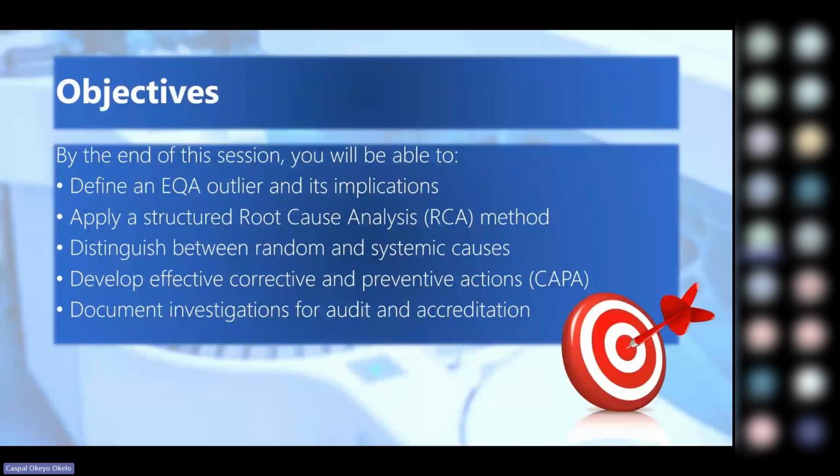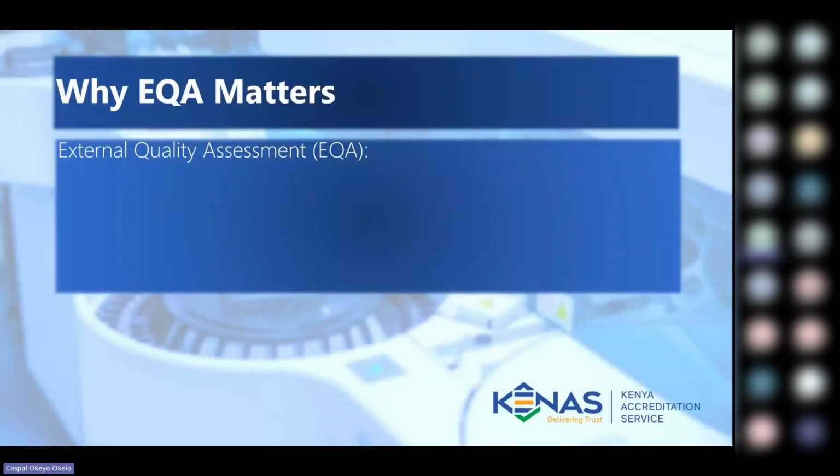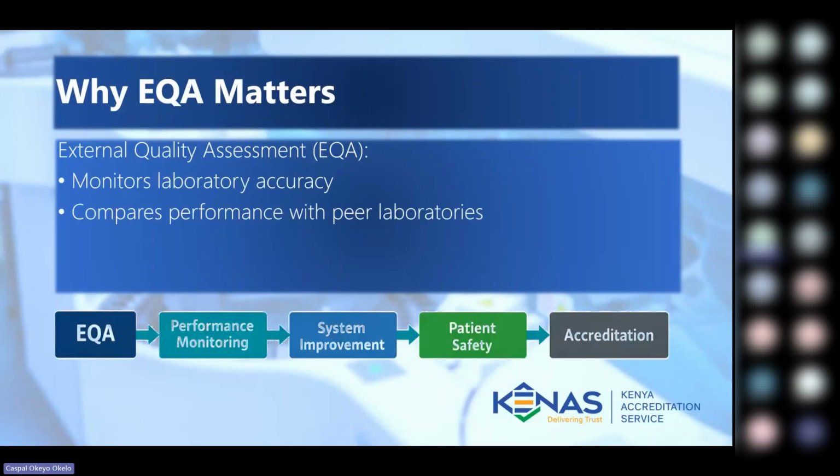Let's proceed. Why does EQA matter? These are foundations that we are setting for the gist of our discussion later on. EQA is not just about comparison with other labs. As we know, it tells us whether our results are accurate when tested against a wider peer group.